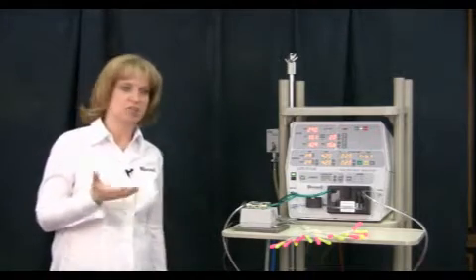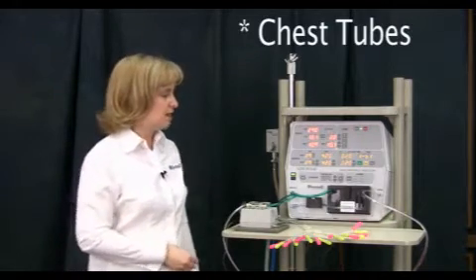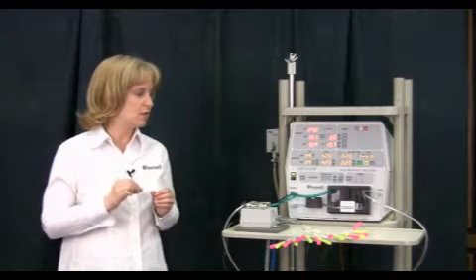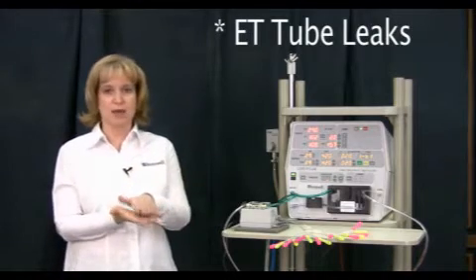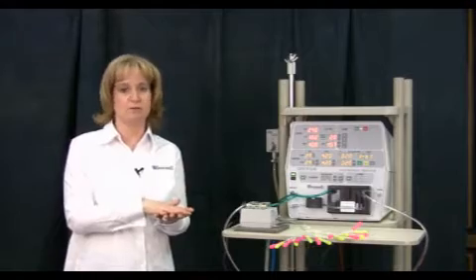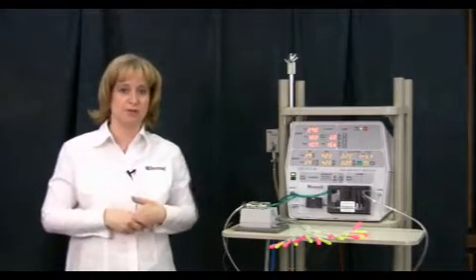Sometimes if that baby has chest tubes, especially multiple chest tubes, you might see some fluctuations in that servo pressure. Keep in mind that with neonates, a lot of times you have air leaks around the ET tube, and a lot of times they're positional. I might position the baby on the right side and I have a huge air leak, or I may position the baby on the left side and I have a very minimal air leak. You want to note those kinds of things and note how your servo pressure responds to that.